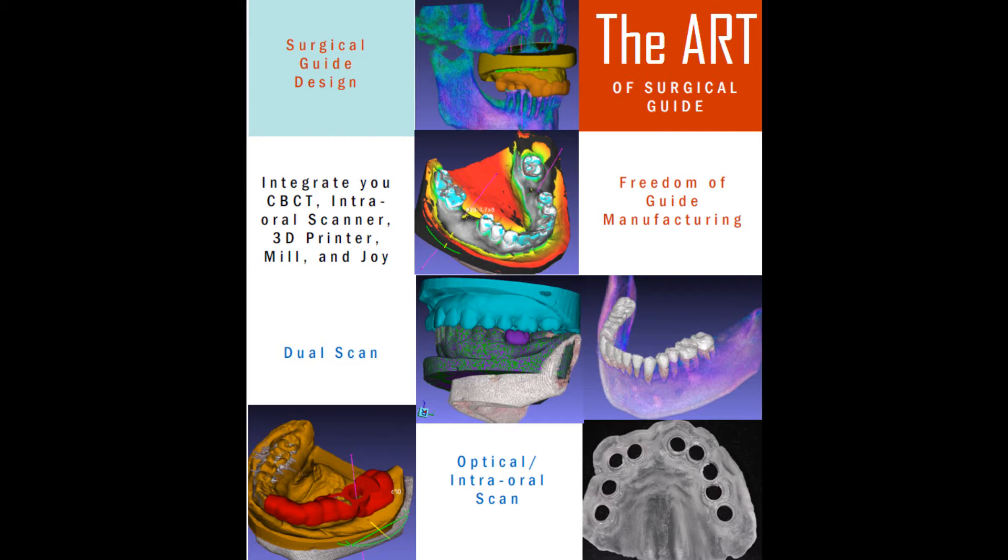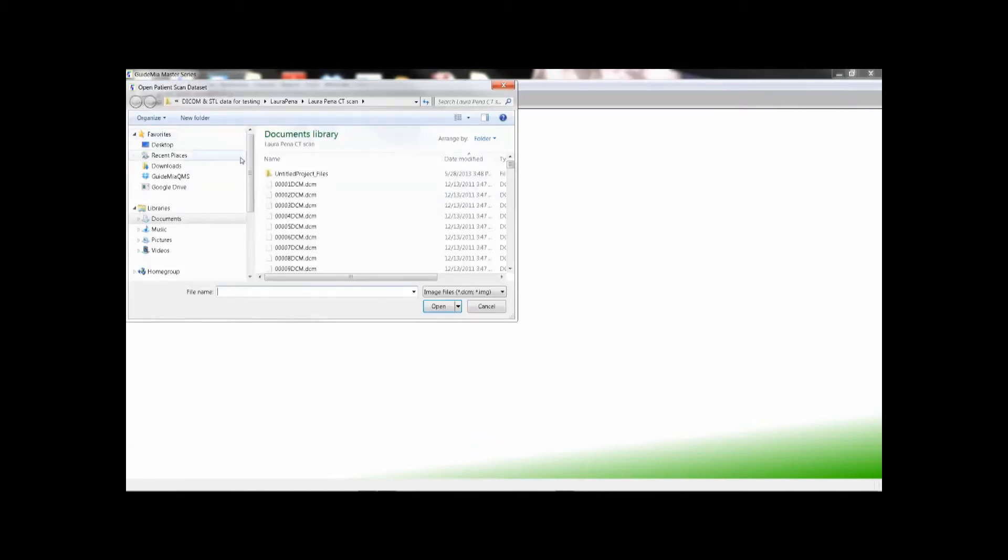GuideMia starts a new project by opening DICOM series. First we select any one of the DICOM files of the patient scan.